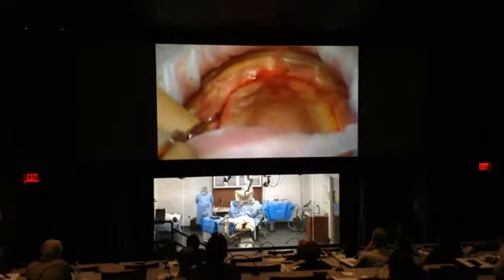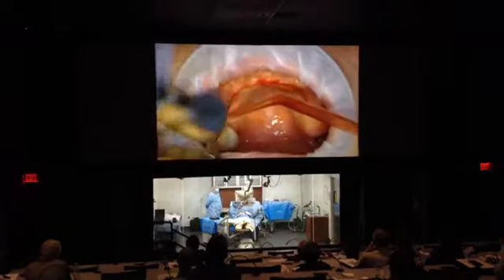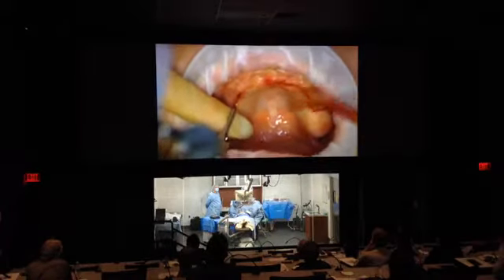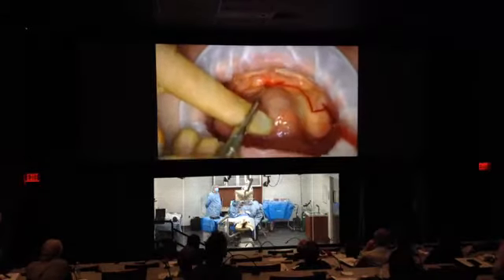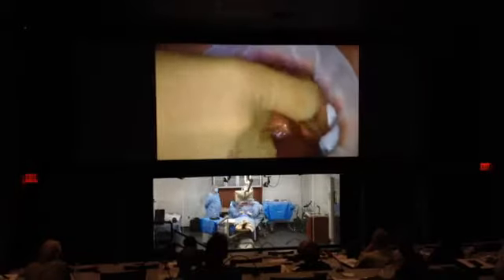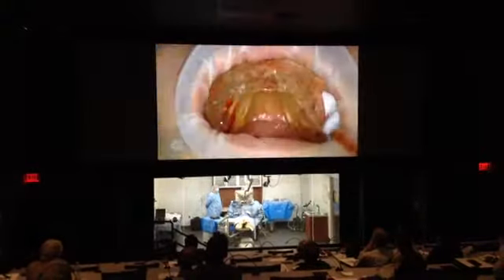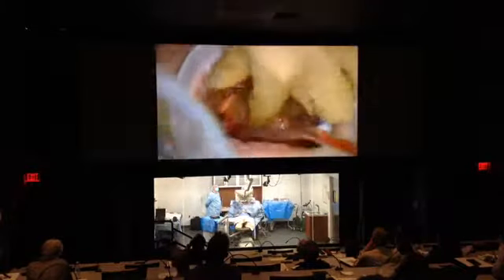Yeah, and you see here I'm stabilizing my blade. Very, very important. Any way that you can stabilize your blade when you're making these incisions becomes very, very important. Okay, let me have the surgical guide one more time. I'm going to put a little bit of gauze back there, just for bleeding, but we should still be able to see the denture here. Let's see. Suction there? Yeah, okay, so I'm good here on this side with my incision.